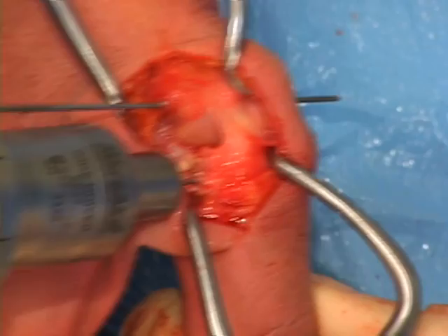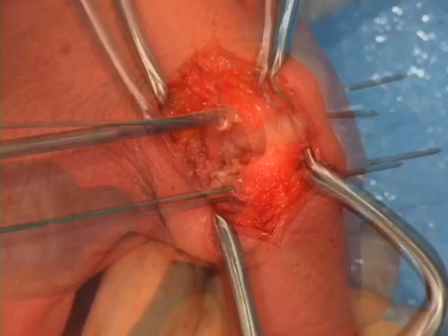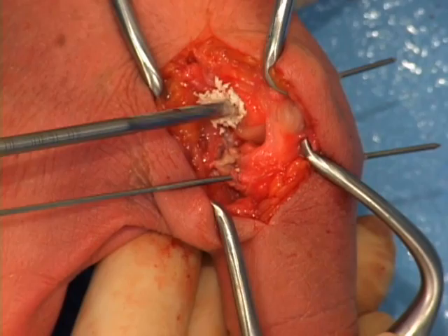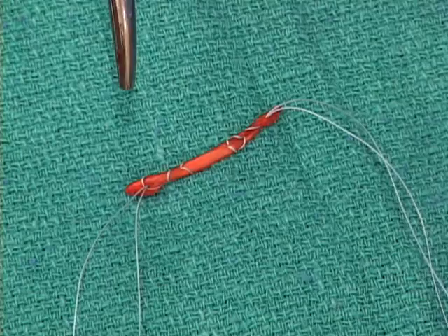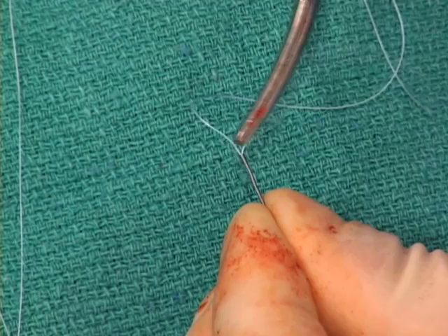Instability of the first MCP joint is demonstrated. A cannulated 3.0 mm drill is used to ream over the guide wires and prepare the bones for the tendon and biotenidesis screw. The drill reams through the ulnar cortex and up to, but not through, the radial cortex. This is performed for both the metacarpal and phalanx.